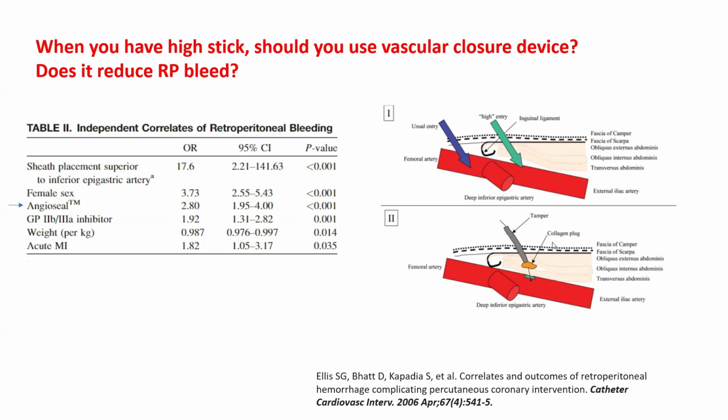And sometimes it can achieve either partial or temporary hemostasis because it can shrink. The tension created by the device can shrink and approximate the muscles and fascia on top of the artery, and that approximation can create a temporary or partial hemostasis, but then the patient bleeds, potentially massively, later on.